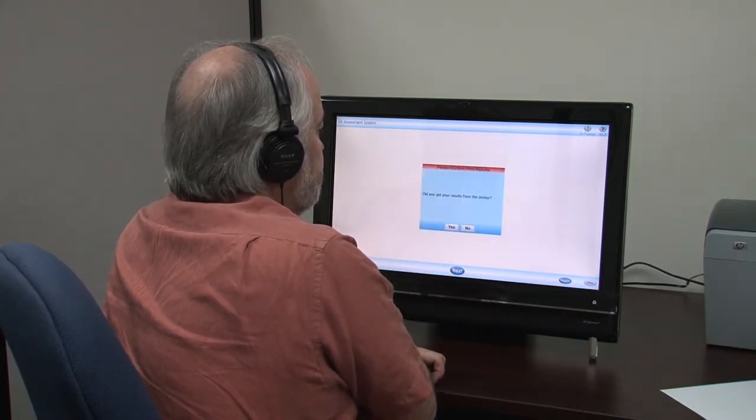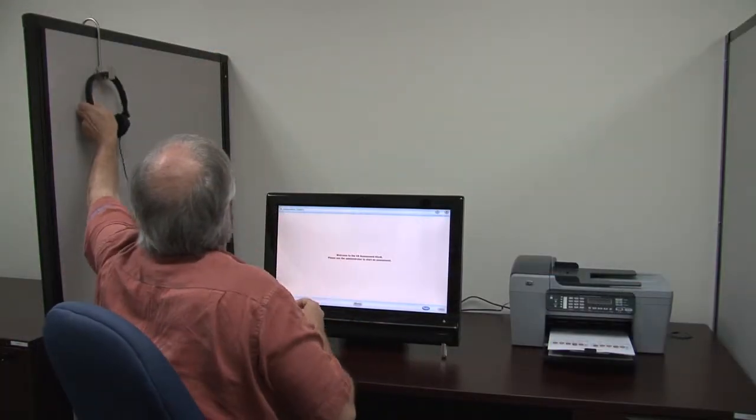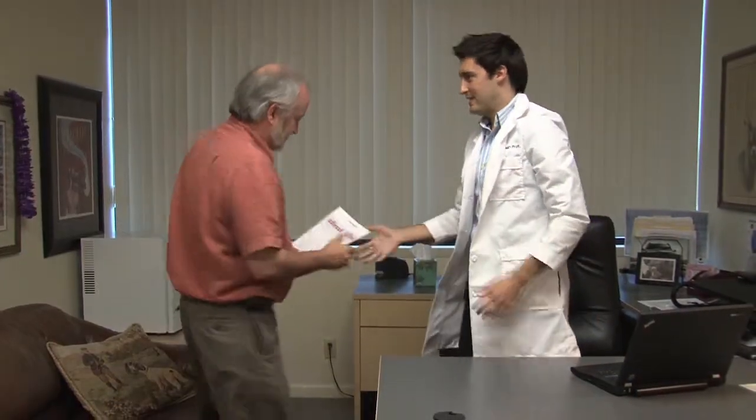Once an assessment is completed, the patient assessment system will print a report for the patient summarizing self-assessment findings and will present educational information based on patient responses. This data is also delivered back into the mental health package for access by the clinician to facilitate more timely interventions and better point-of-care decisions.